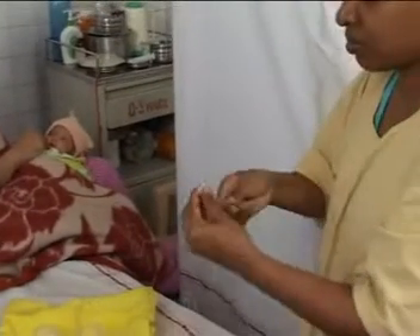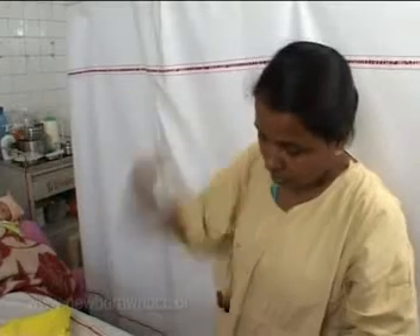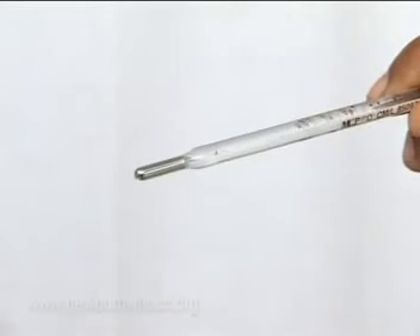Place the bulb end under the baby's arm in the middle of the armpit, near the roof of the axilla. Remember, the thermometer should be kept parallel to the body.